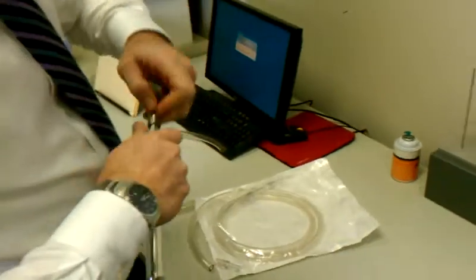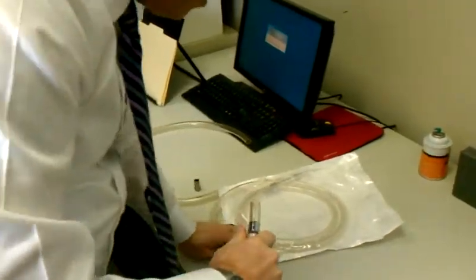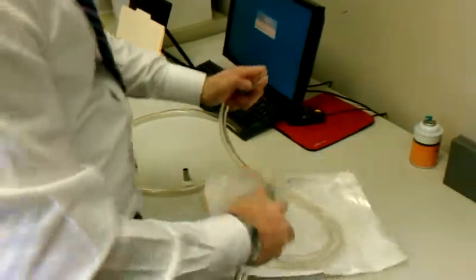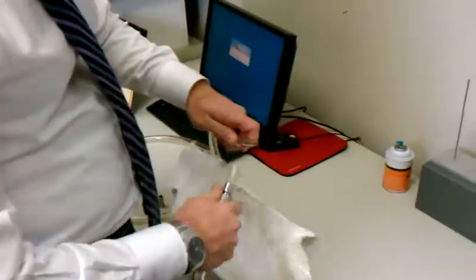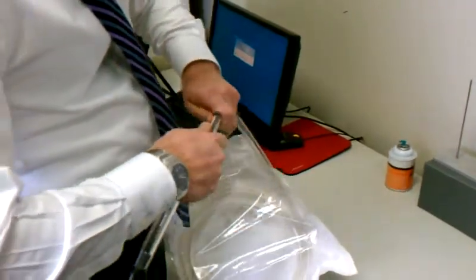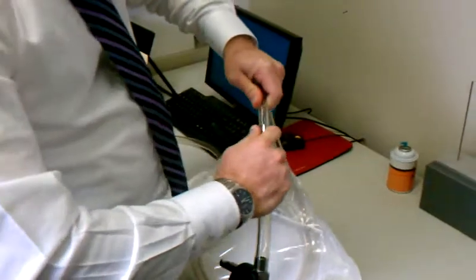Every time when you want to use this tubing set from the Acme, you simply use that adapter, and that'll make a nice, snug fit. So that's the way you adapt this bottle assembly to fit the Acme disposable tubing.